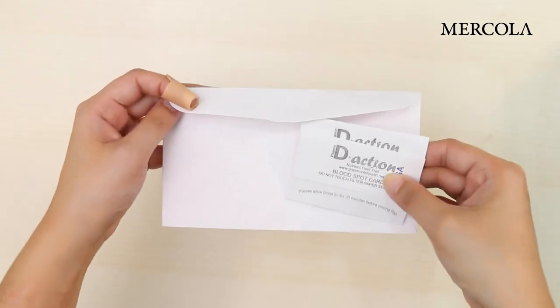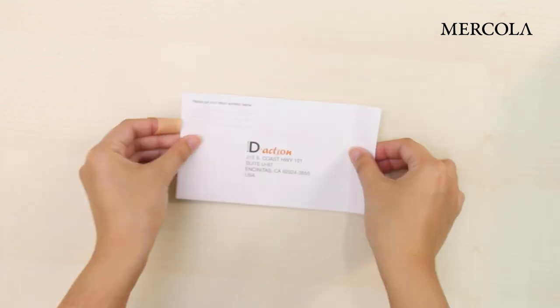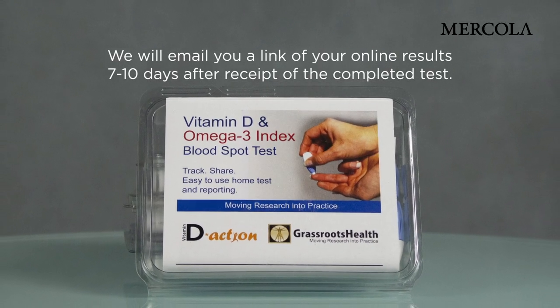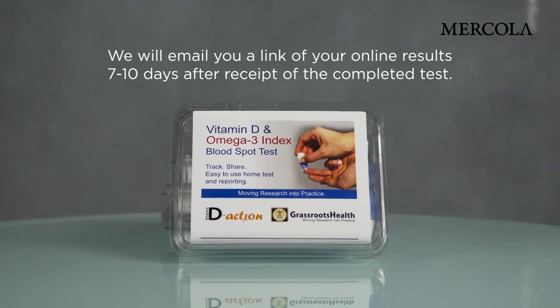Place both cards in the enclosed envelope, write your return address on it, and put it in the mail the same day. We will email you a link to your online results 7 to 10 days after receipt of the completed test.